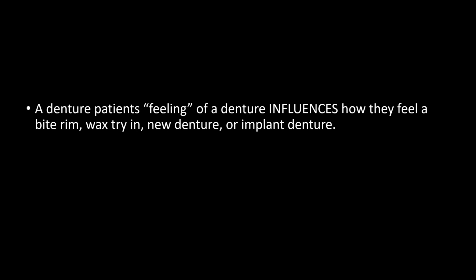From the time that the rim is inserted in the mouth, and we tinker with it, we're asking them to give us critical information when the central nervous system is trying to understand what it's feeling, because it hasn't felt that before. So you have to watch how you shape wax rims. That's part of the architecture of understanding a denture, and understanding how the muscles and the brain have learned to understand what they're feeling inside the body and inside the mouth.